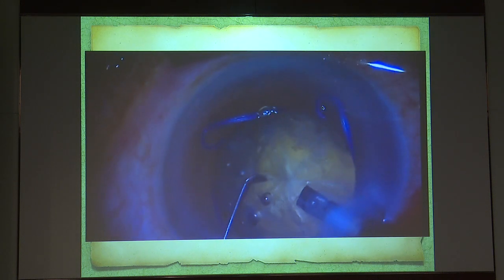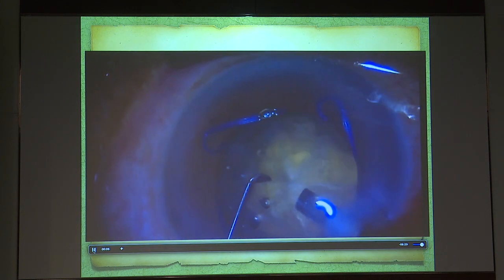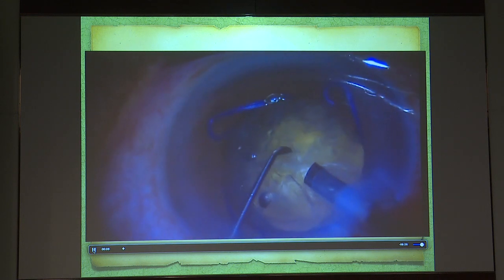I've started, the rexis is removed, and I've started phacoemulsification. So you can see the same ring is in place. Now notice 2-3 things. The whole nucleus shakes, obviously, because there's no counterbalance, there's no counter traction, there is no support, and there is a subluxation.